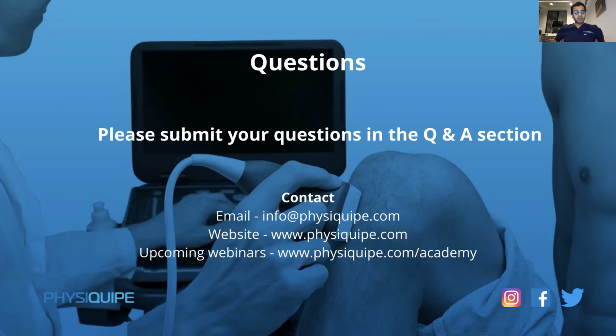Patients may come out and say, well, I only get pain when I'm abducting my shoulder, doc, or when I'm stood up, or I get back pain when I'm stood up. There's various connotations, yet when we scan, we're scanning them in a non-physiological position, and the information we glean out of those scans is in a non-physiological position. Sometimes that will give us the information and highlight the pathology, but there might be a very small cohort of patients where the scan doesn't necessarily turn up the right answer.